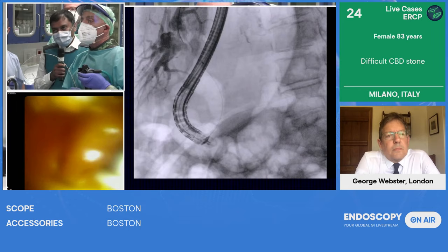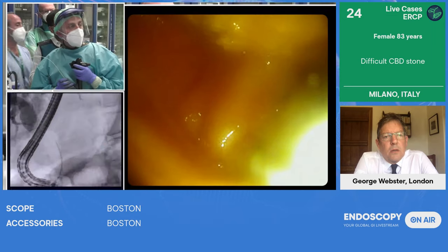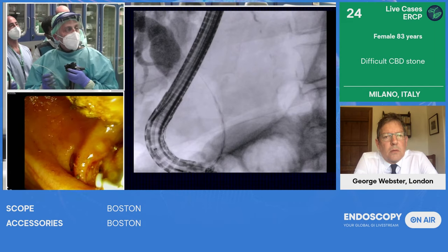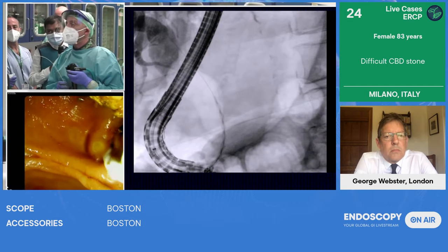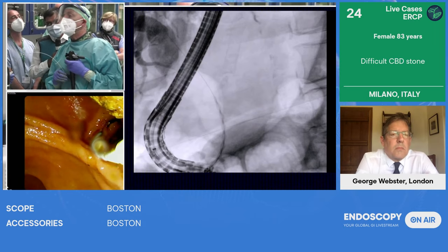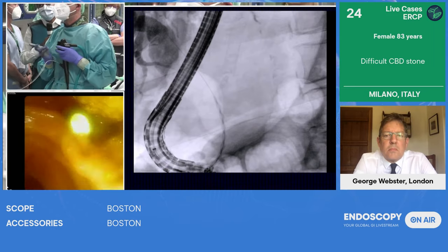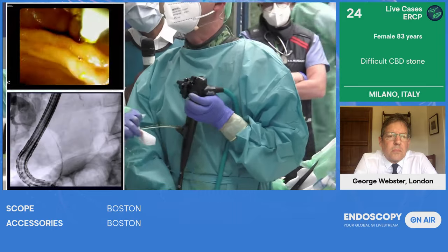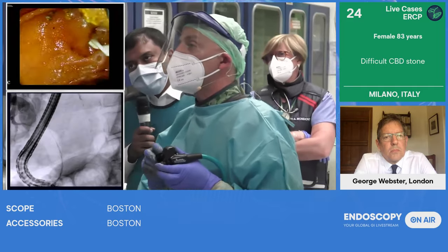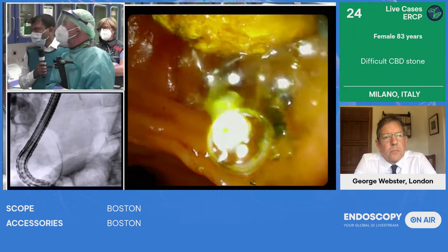Awesome. This is another very interesting situation. Definitely, Alessandro. This is the chain, and I think it's pretty clear. The system was invented by Archimedes in the 3rd century before Christ. And it can drain either from the inside. Look at this, I'm removing the wire. So either from the inside or from the outside because of the helicoidal shape. We choose the long-lasting stent that is 3 months in order to ensure a proper drainage.